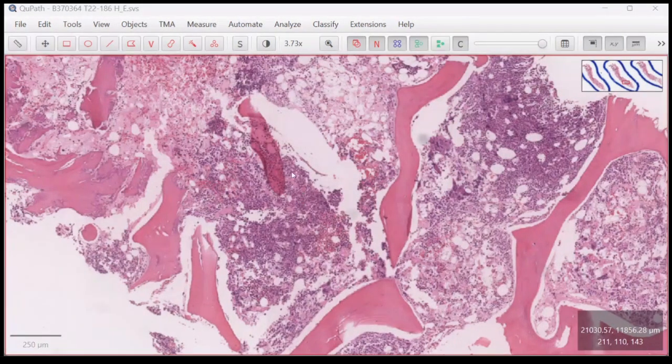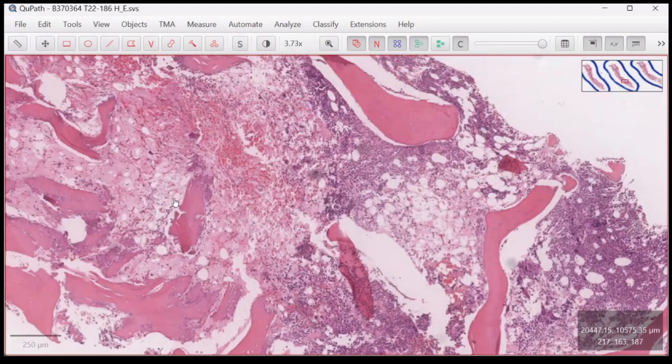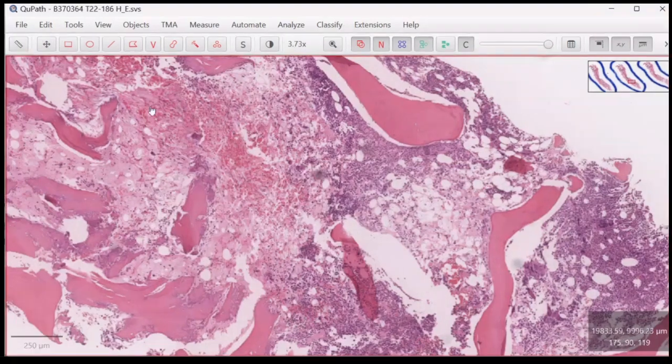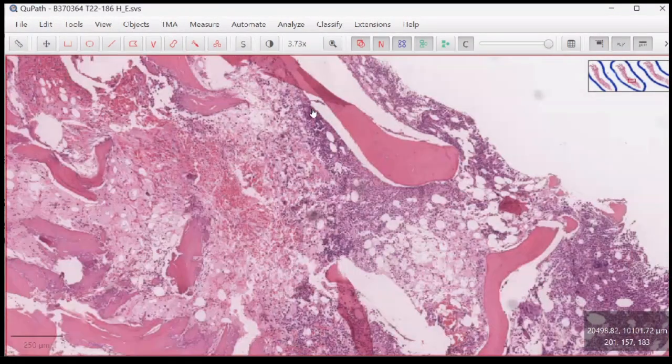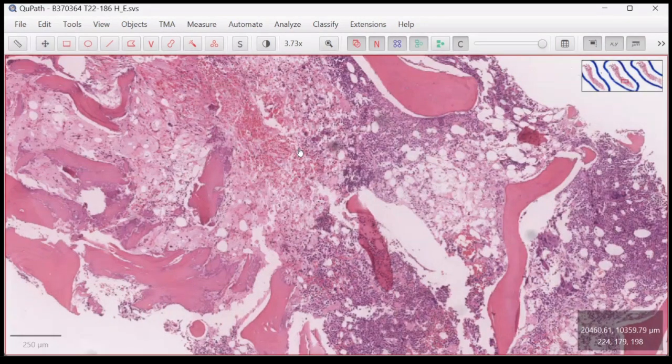Check on CC8. Dr. Ahmad, based on H&E, the area above there is an area of necrosis, is it? The pinkish material, yes. This is what we call the proteinaceous material replacing the fat spaces. This is commonly seen in post-chemo. So sometimes you get the transition of post-chemo changes here.